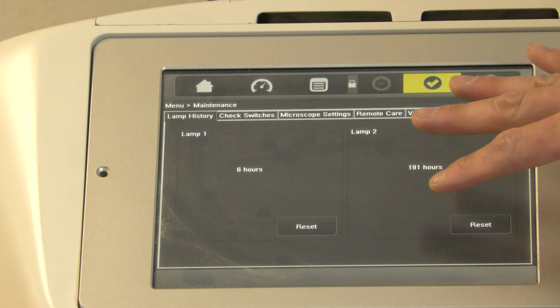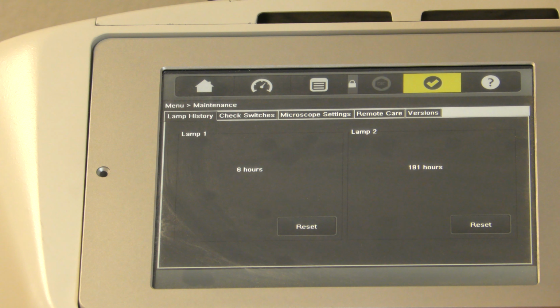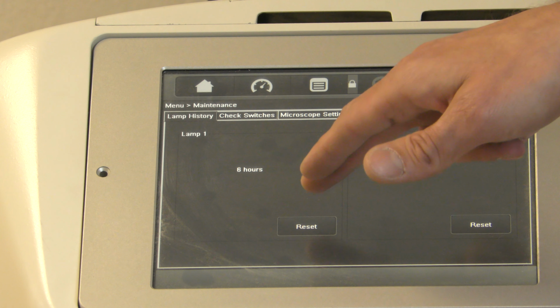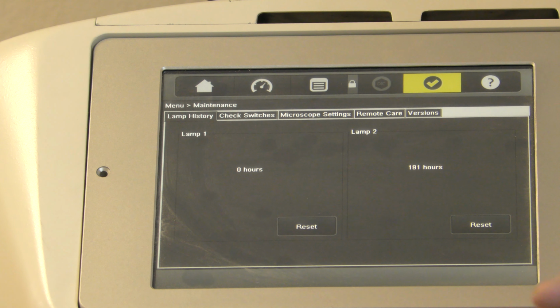So to go over this, the database does not link to the bulb in any form or fashion. The count starts when you reset this. You reset it by double clicking that, and it'll reset to 0. So it counts from 0 up to 500.